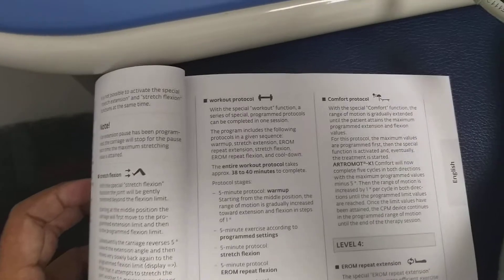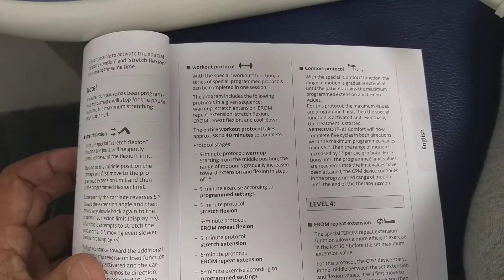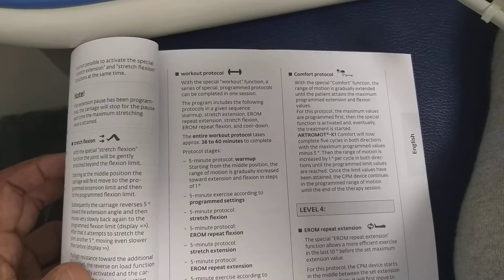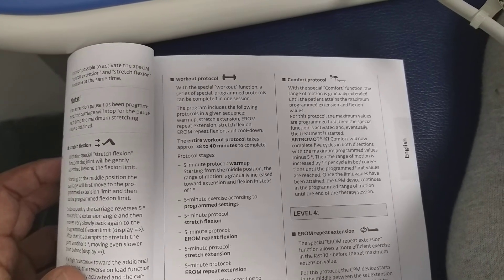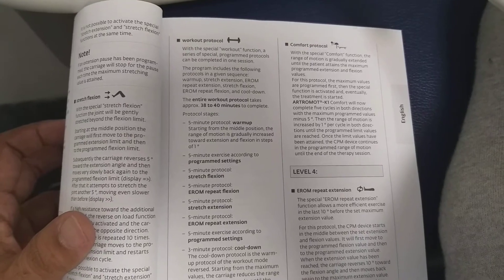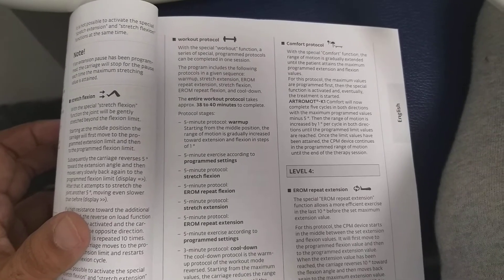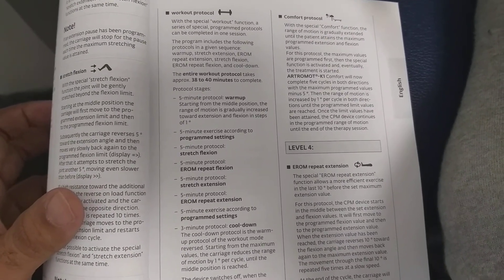This is the workout protocol, where there are 5-minute exercises according to the program setting, beginning with a 5-minute warm-up. The entire protocol is 38 to 40 minutes, comprising warm-up, stretch extension, E-ROM repeat extension, stretch flexion, E-ROM repeat flexion, and cool-down — all treatments of 5 minutes each. The first 5 minutes is warm-up, then 5 minutes for stretch extension as per the setting, then stretch flexion.